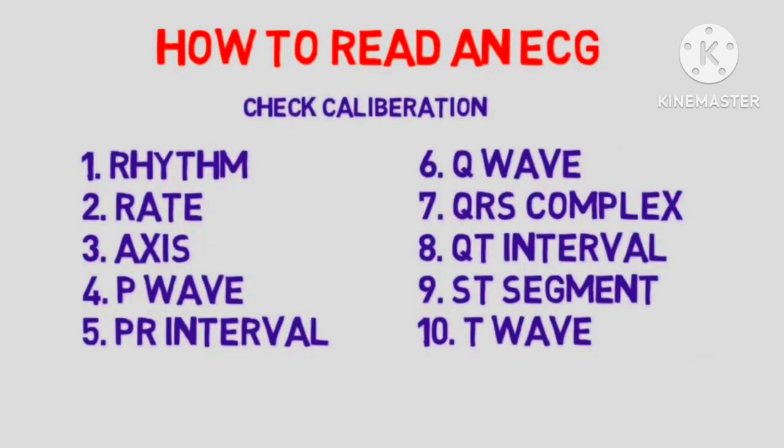So, this is all about ECG. Always think of these 10 steps in this manner.